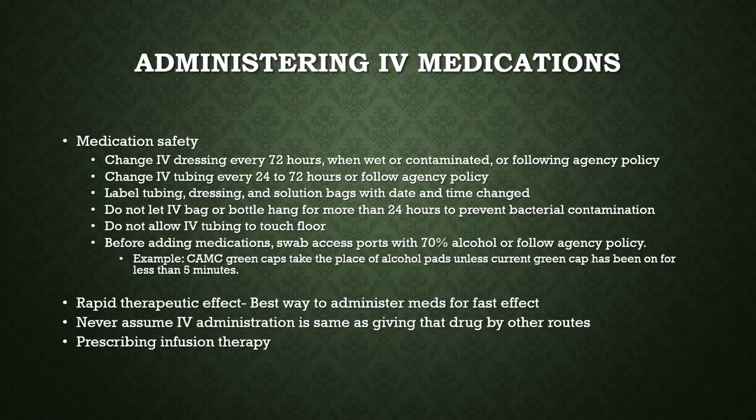If someone is a very hard stick and an IV is in a very precarious spot, you want to be careful about taking all that dressing off because it may move the IV cannula around and cause you to lose your IV. So you've got to be real cautious with that. That will keep a lot of people from changing their dressing like they should, but it still should be done. Now the IV tubing should be changed usually either every 24 or every 72 hours depending on your hospital policy. Most IV bags with fluid in them need to be changed every 24 hours.